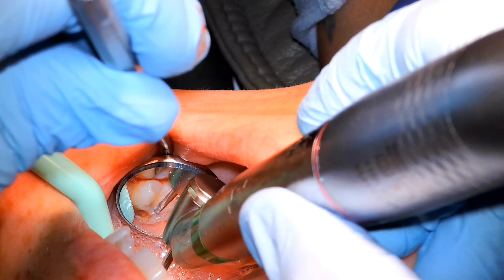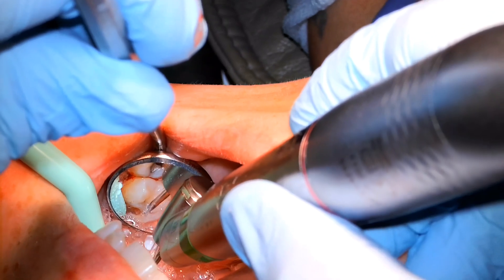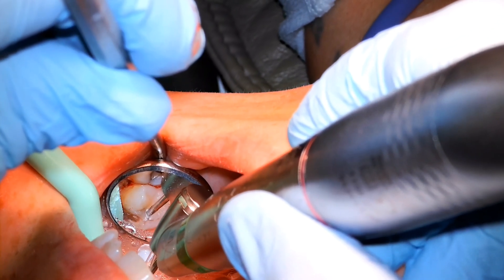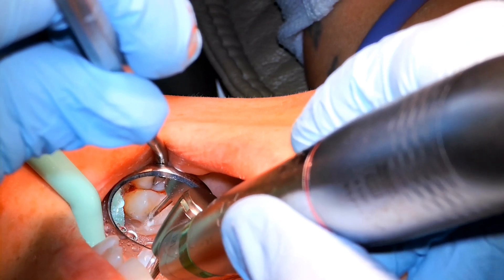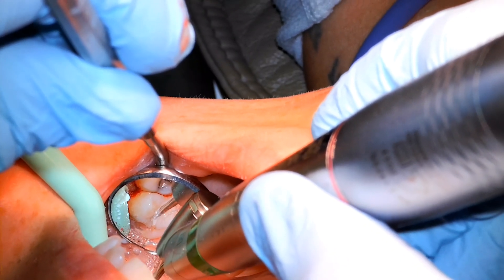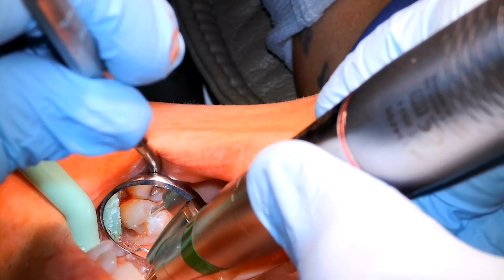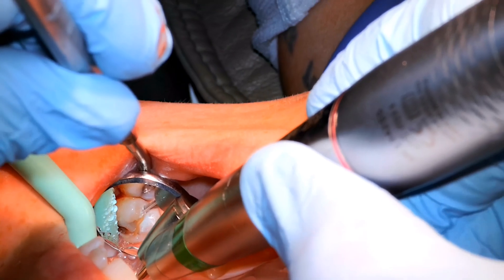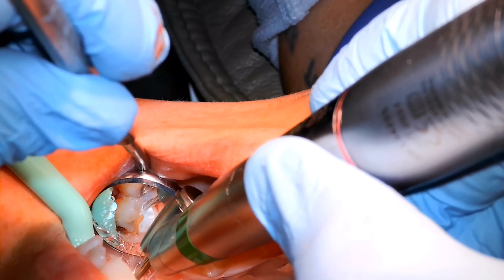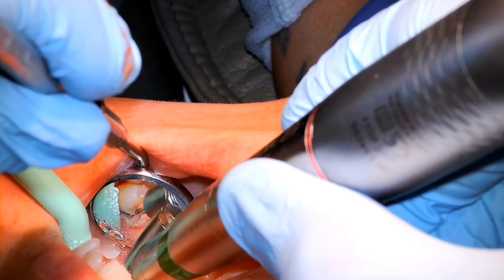We're going to section the tooth using a 45-degree NSK electric surgical handpiece. I'm showing you in the mirror here — you can certainly section looking in the mirror, but if you can use direct vision that's usually better. For the purposes of the video, you want to be seeing what I'm doing, so we're trying to show you that here.